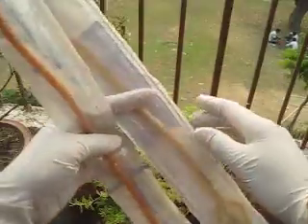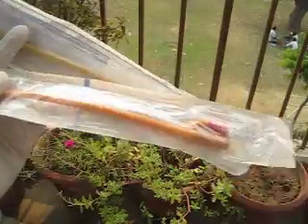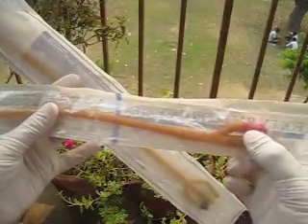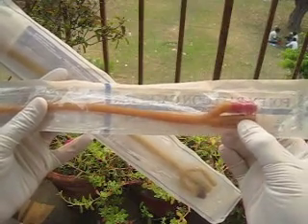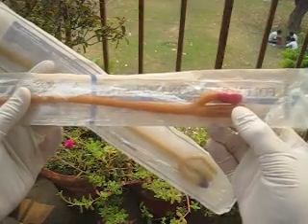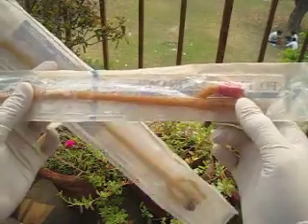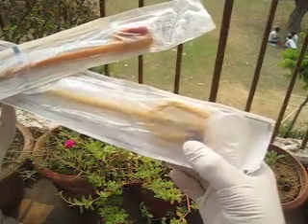Hi friends, I'm showing you two different types of catheter. This is a two-way catheter — here you can inflate the balloon, and here you attach the urine bag. Every catheter has a color coding according to the size. This red color is 18 French, and this purple color is 22 French.